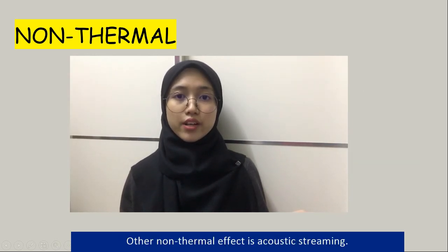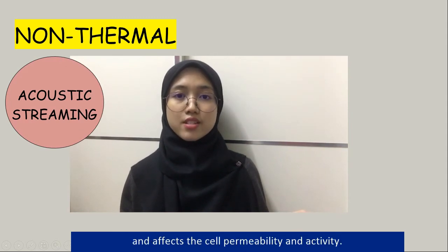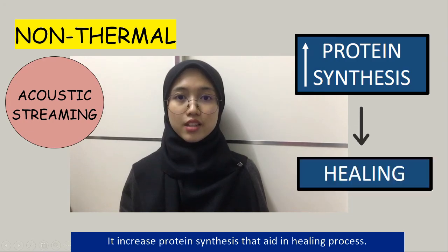Another non-thermal effect is acoustic streaming. Acoustic streaming provides steady circulation of fluid around cells and affects cell permeability and activity. It increases protein synthesis that aids in the healing process.